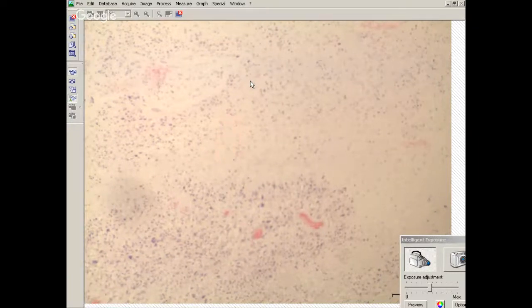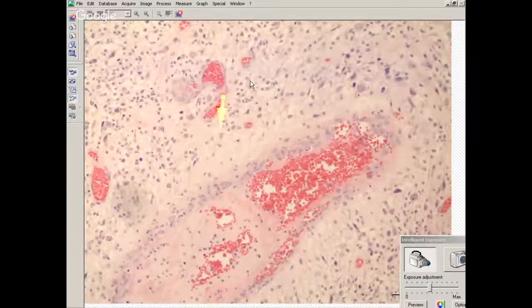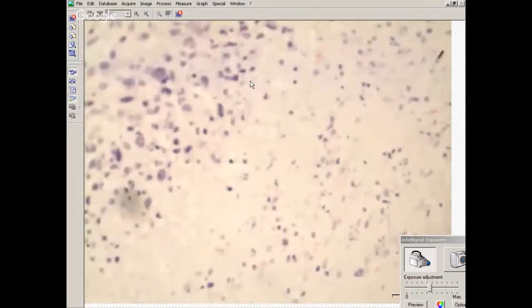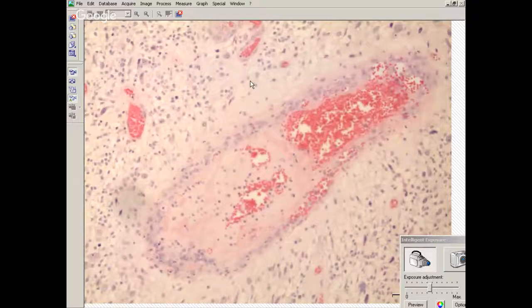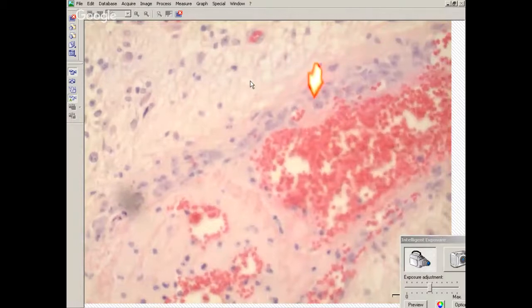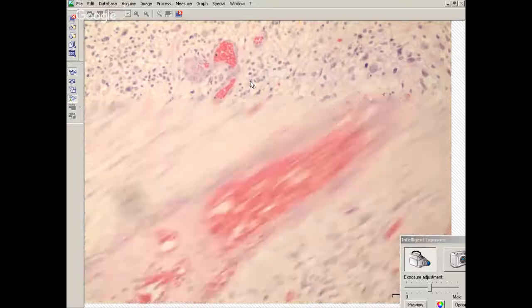is in the brain parenchyma, with high cell density. The blood vessels are not normal. If you look at the blood vessels, a lot of them have too many endothelial cells, or what look like endothelial cells. So in this example, there are at least three cells thick of abnormal endothelial-like cells. So this is vascular proliferation, or endothelial proliferation, or whatever you want to call it.